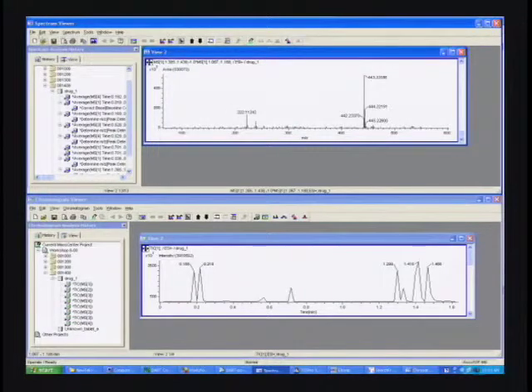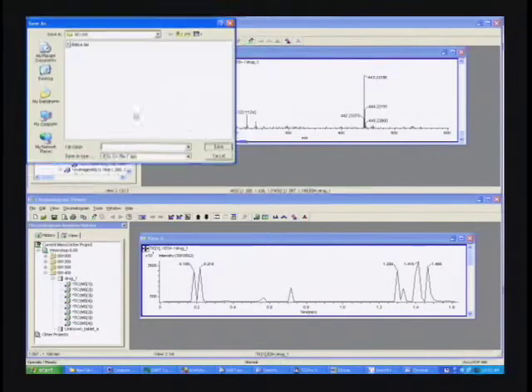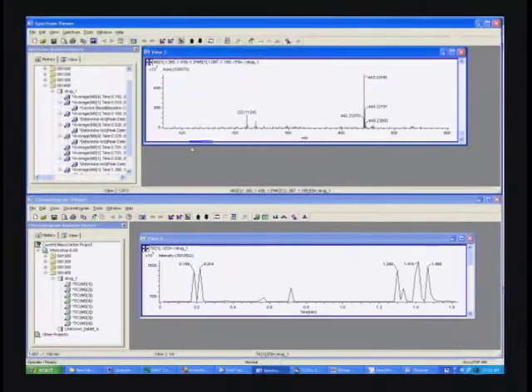And then we'll need to save the data into a data file, and we'll go File, Save As, and we'll use the JEOL DX, the text delimited file, and we'll need to put that in the correct place here. And we're going to call that 081408. And we'll open that and we'll put this in. And this is unknown 4, and we want to label that with some indication of the voltage that we use. In this case, we'll label that with a 20, and that will indicate that it was the 20 volt spectrum.